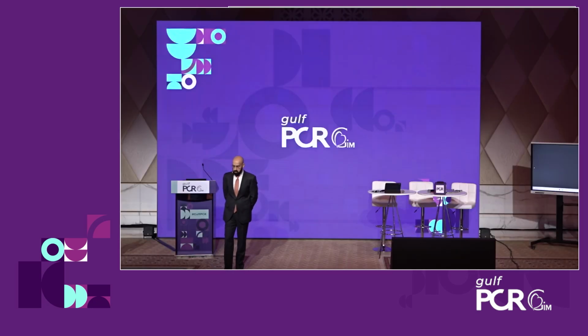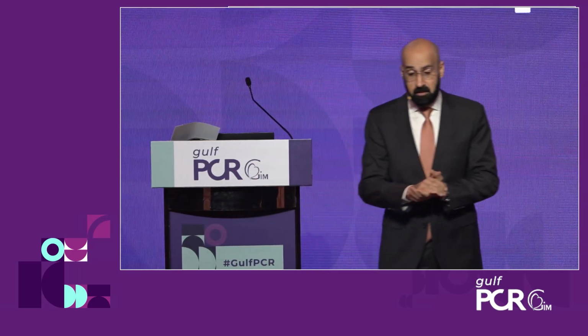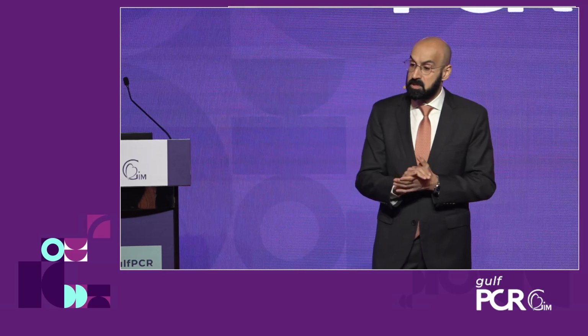Yeah, I agree. I think any valve you are placing, you need to know how to handle it, and you need to know the features of the valve. As correctly stated here, the features of this valve are low pacemaker rates, because the radial force really is not as strong as the other competitors. The other thing is the outer crown design, to lower the risk of coronary occlusion. So those are all features. Pre-dilatation is very important in this valve design.